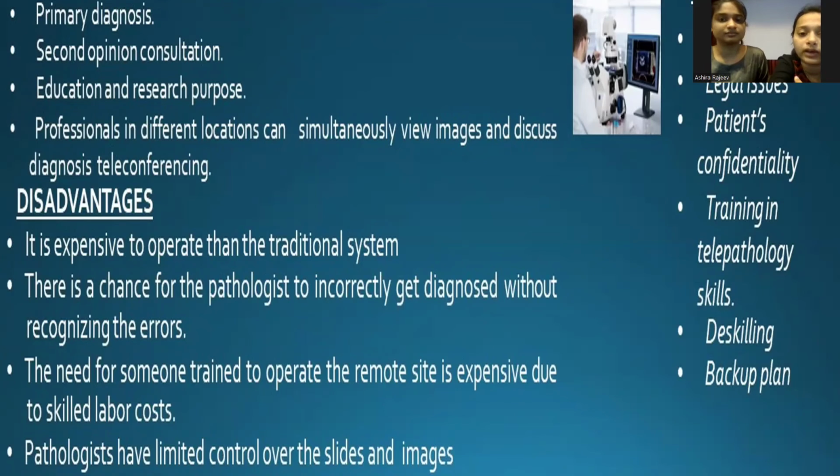De-skilling or loss of relevant local expertise can occur if particular category of specimens are routinely allocated to report over a long-term period. Backup plan: laboratories must have procedures to maintain activities in the events of equipment failure. There must be procedures in place to ensure sufficiently rapid repair or replacement of sophisticated equipments.